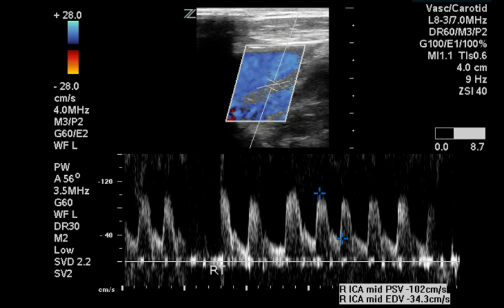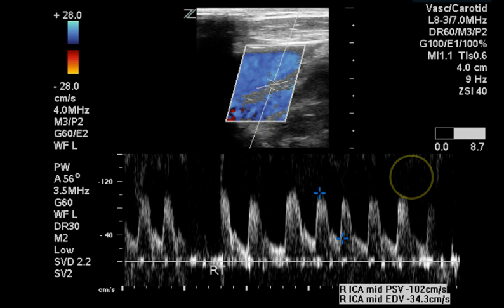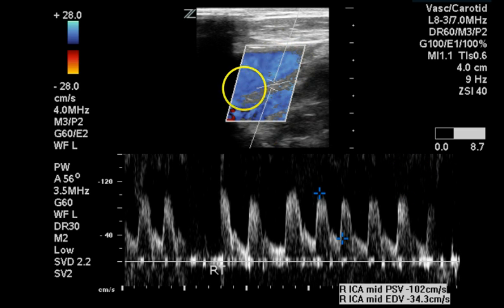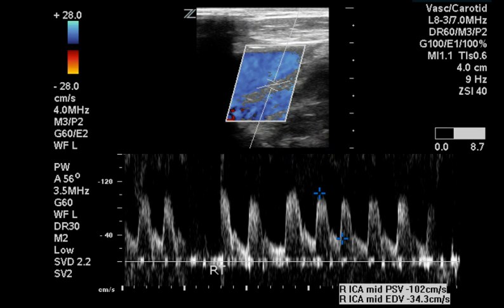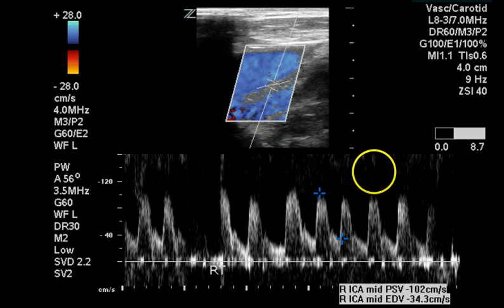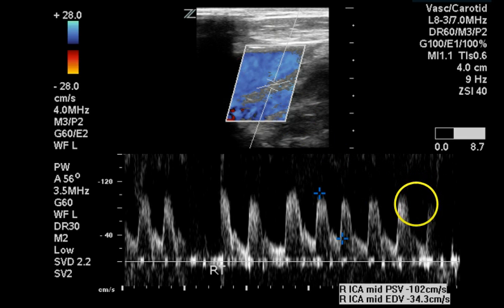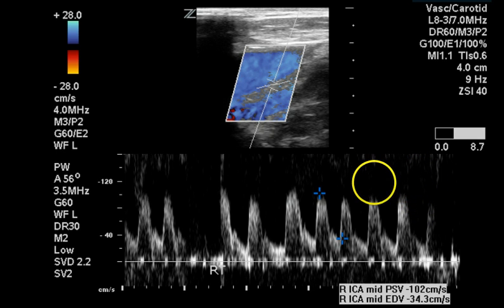This is an image reported to be in the mid internal carotid artery. It appears to have been frozen at an inappropriate time because there is no evidence of flow in the Doppler gate. The patient may have been moving significantly during this portion of the study, though in defense of the sonographer.